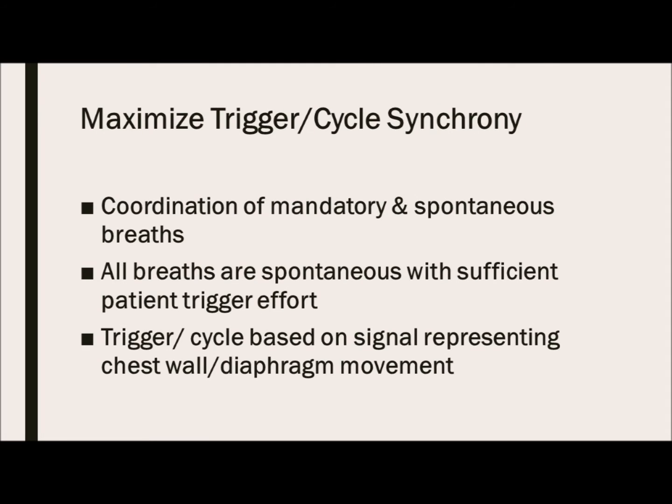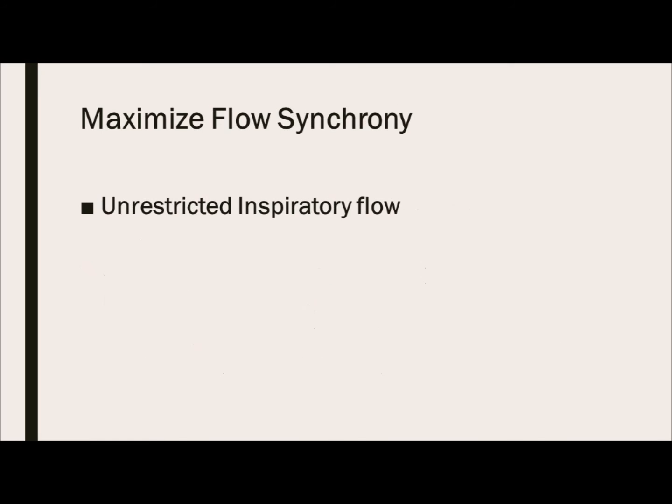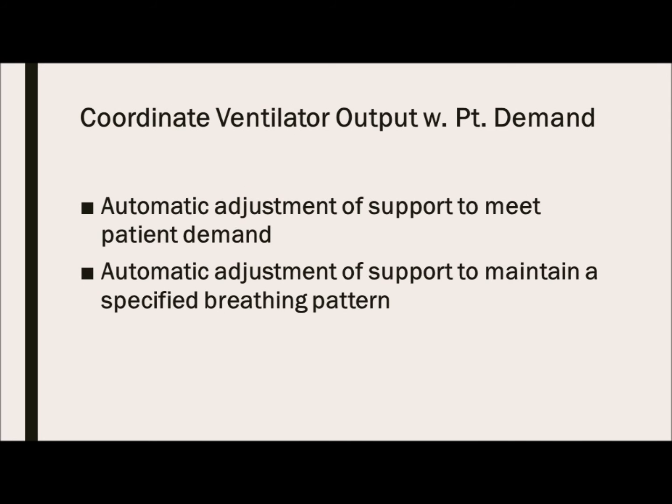Does your mode allow for the coordination of mandatory and spontaneous breaths? Are all breaths spontaneous with patient effort? And is trigger or cycle based on a signal representing chest wall or diaphragm movement? Does your mode provide unrestricted inspiratory flow? Does your mode allow for automatic adjustment of support to meet the patient's demand? And does it automatically adjust the support to maintain a specific breathing pattern? Can your mode automatically limit auto PEEP?